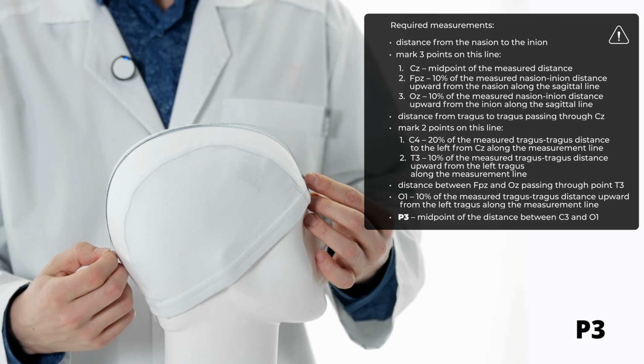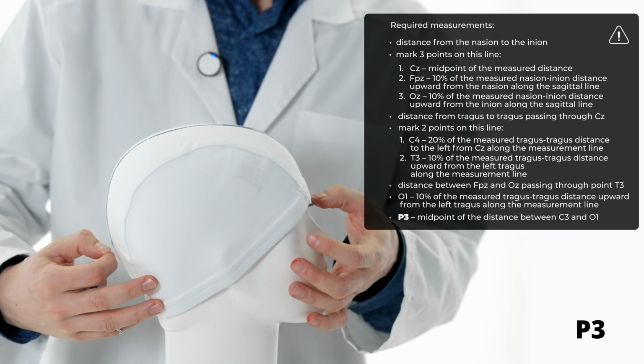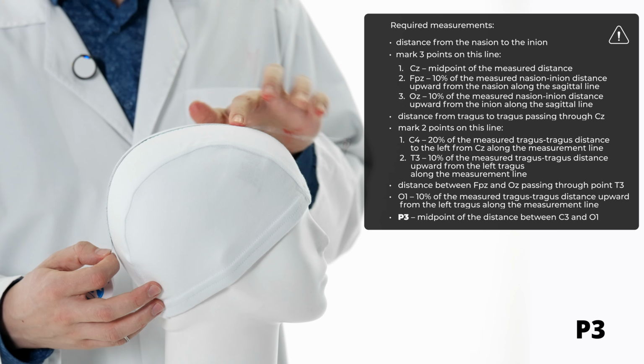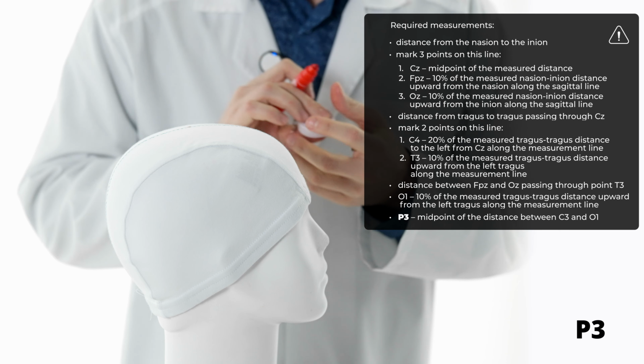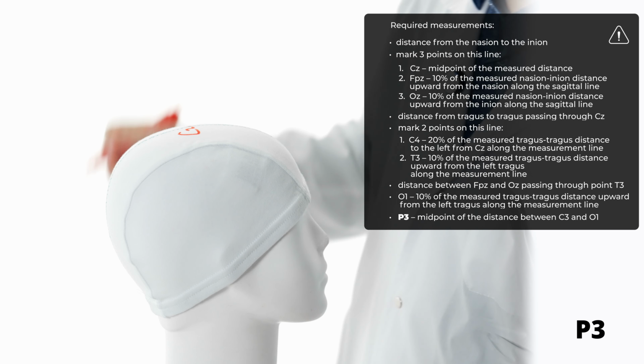In our case, this distance equals 32 centimeters. Along this line, mark 3 points. The first one is CZ point that lies right at the middle of this line, or in our case, at 16 centimeters from the nasion or from the inion. Mark CZ point.